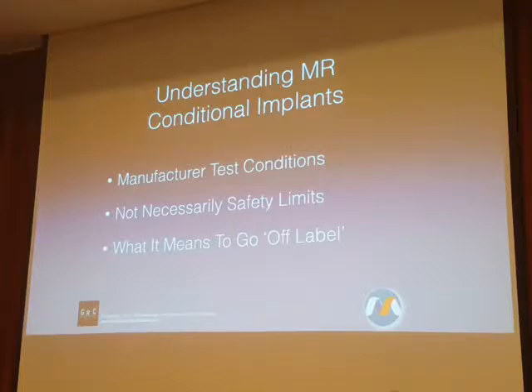So even though they went from 720 to 7,000, increasing it by a factor of 10, they could have doubled that. They could have increased it by a factor of 20 before they even got close to a theoretical safety limit that really isn't a safety limit if the exposure in this direction is the exact same thing as the exposure we always have in this direction.